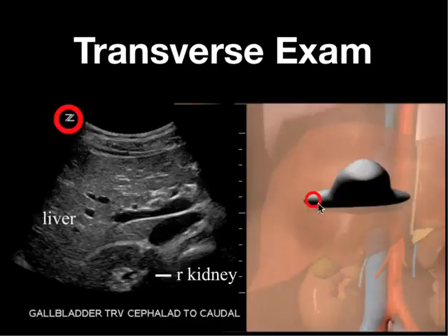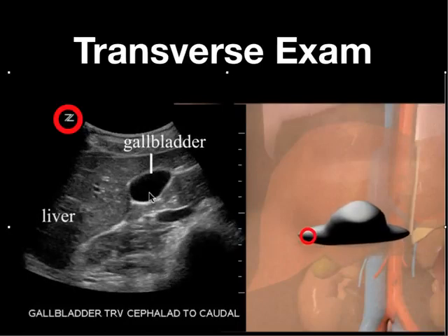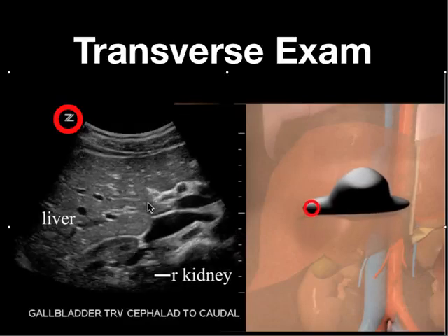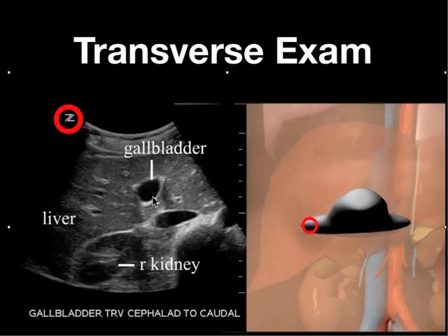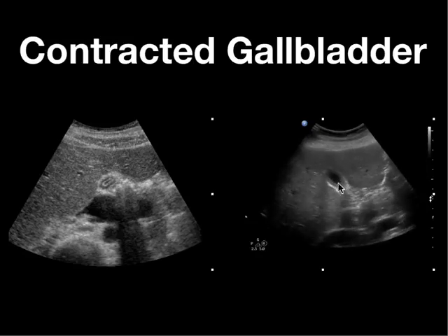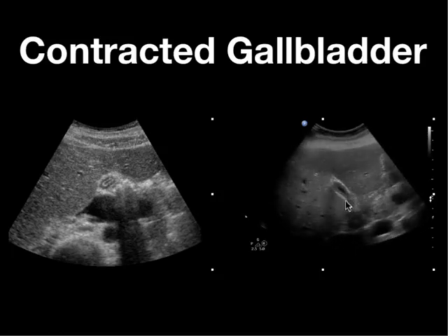Here's a transverse exam, a sweep going from the cephalad region caudally. As we start off you can see the gallbladder; now we're moving down towards the fundus, and as we come back up, this is going to be the gallbladder neck. On patients who have an S-shaped gallbladder or a relatively tortuous neck, it's easier to follow the neck in the transverse plane. Here are a couple examples of contracted gallbladders in the transverse plane — here you can see the wall and the lumen, but there's essentially no bile in there.